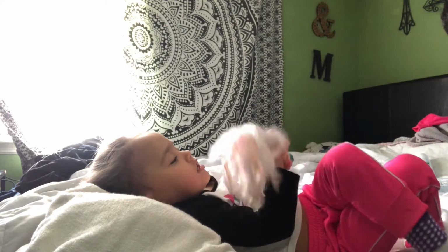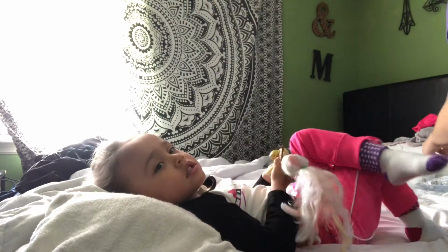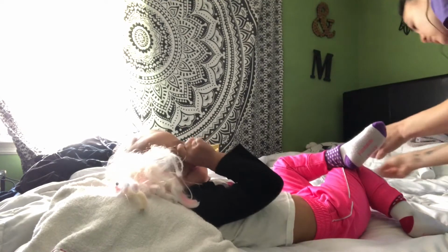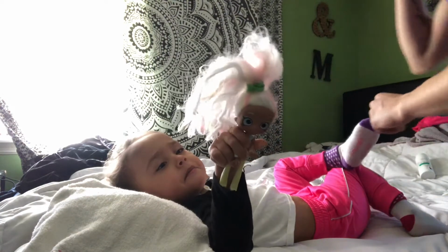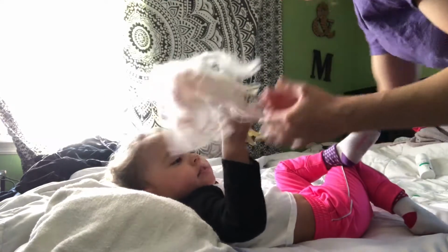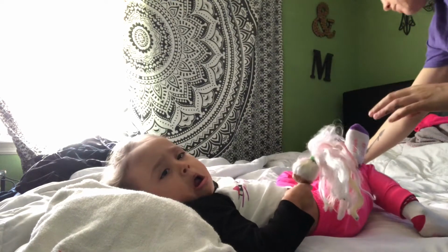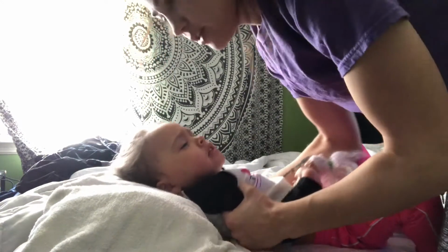One of the gauzes I wet with saline and use as a wipe to clean it off. The other one I keep dry, and that is the one that goes underneath her trache. Some people don't like to use gauze underneath their trachs. I know some parents in some other groups don't use gauze at all. I do, only because I've seen that it helps La'Nova with irritation, and she doesn't get too much gunk underneath it, so it's just for cleaning purposes. It's a preference. And sorry, the birds are going a little crazy.